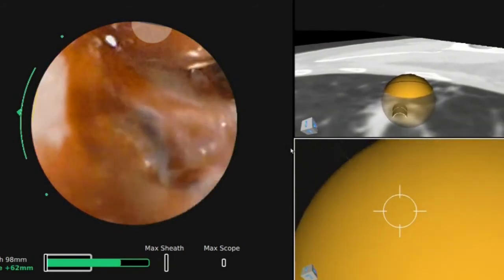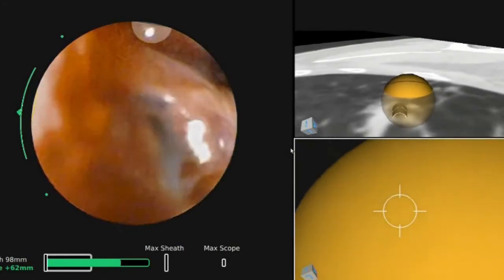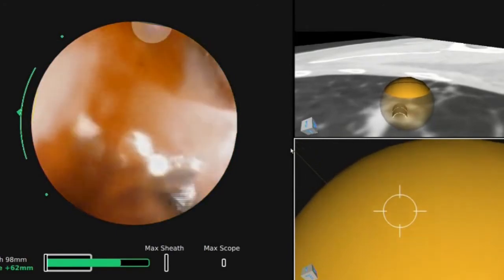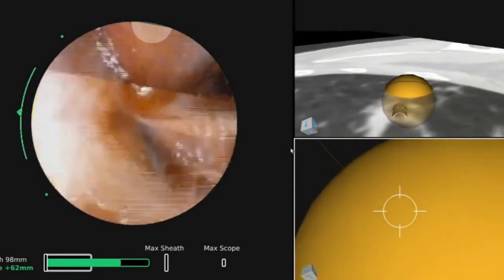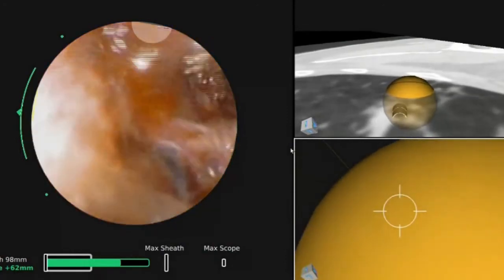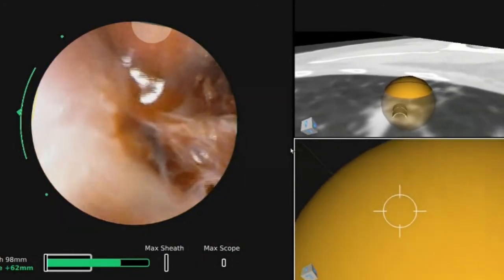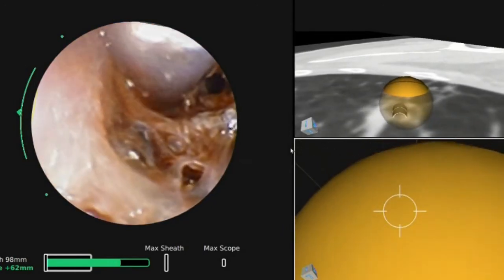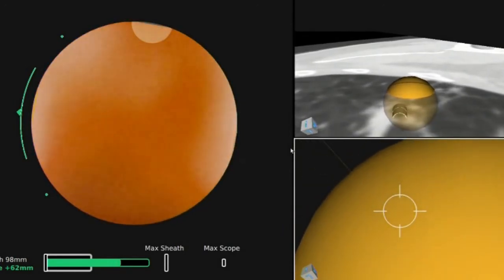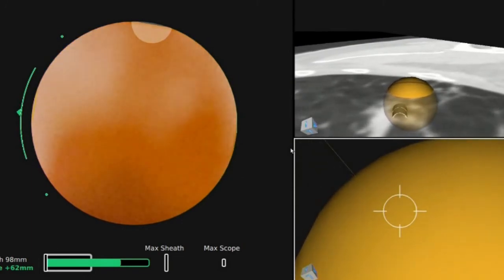In addition, the video bronchoscopic view shows biopsying of the nodule under direct vision. Multiple instruments were used to biopsy the nodule for this patient: needle aspiration, followed by cytology brush, forceps biopsies, and bronchoalveolar lavage were utilized to obtain sufficient specimen.